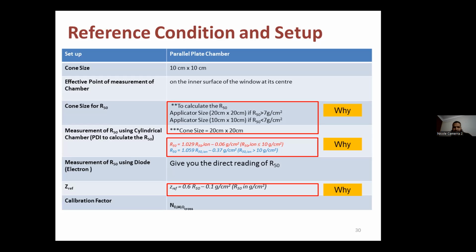So yeah, ZREF. What is the ZREF? ZREF is the position that is not the Dmax position of the energy. So when you do your measurement, you are not measuring your output at the Dmax of the energy. You are measuring at a depth which is pretty close to the Dmax, specifically with a low energy. But with high energy, it's significantly different from your Dmax.